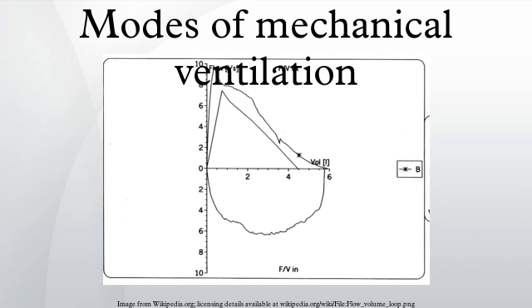High-frequency ventilation. The term passive refers to the ventilator's non-forced expiratory system. In an HFVP scenario, the ventilator uses pressure to apply an inspiratory breath and then returns to atmospheric pressure to allow for a passive expiration. This is seen in high-frequency jet ventilation, sometimes abbreviated HFJV.